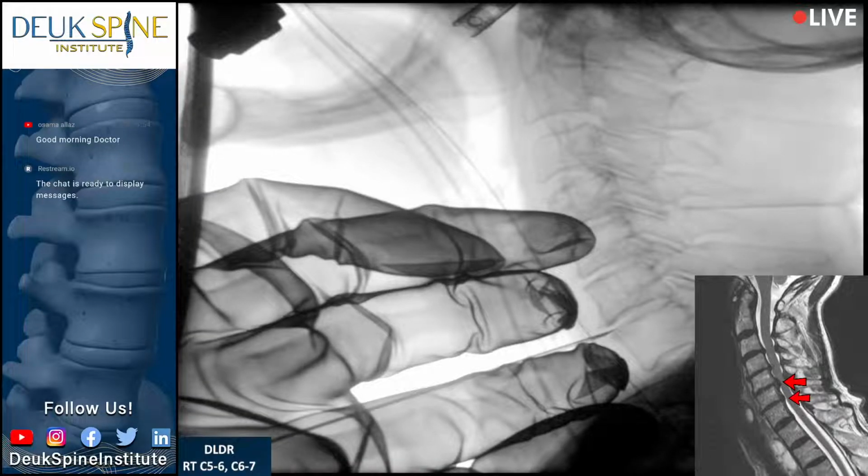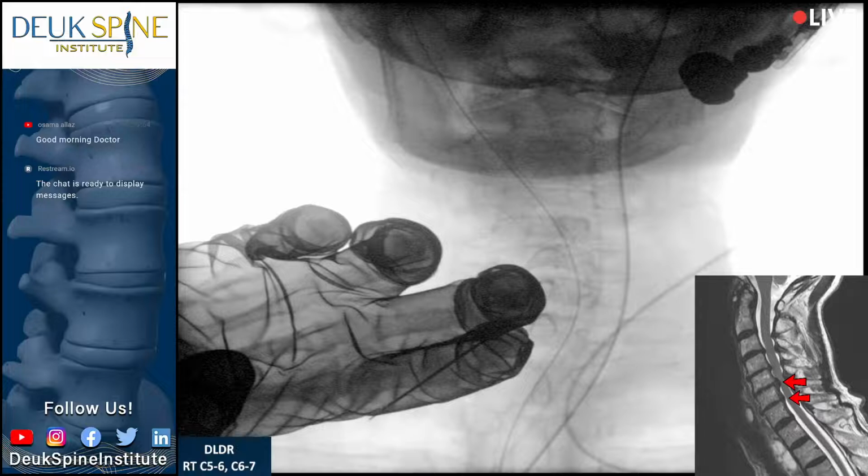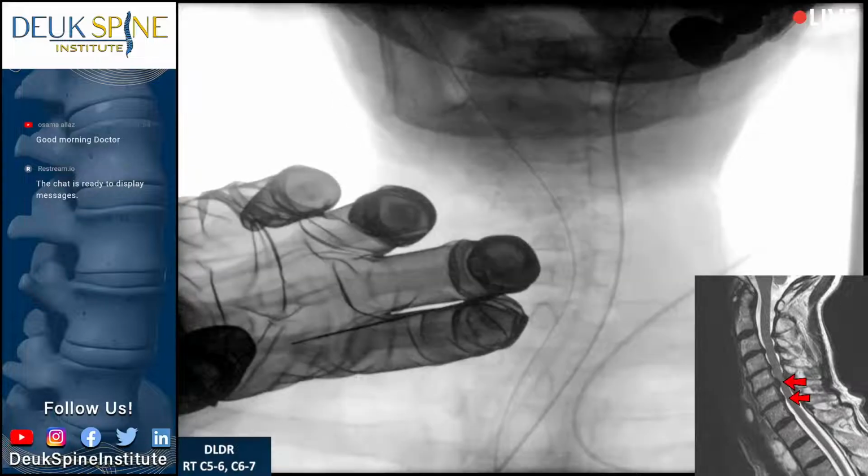So the nice thing about this patient's neck for me as a surgeon is it's thin and her spine is anterior. That looks pretty good. Give me an angle. No, rotate it south. Yep, shot. I want to see where the tip is. All right, that didn't really help me. It looks like we're a little off to my side. So go back to a lateral.